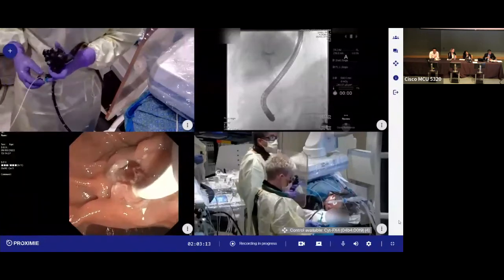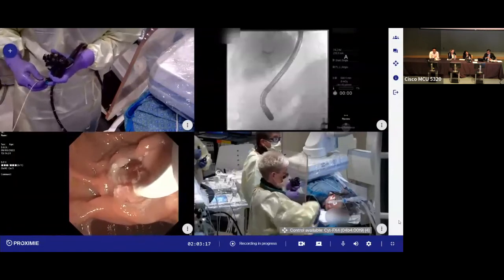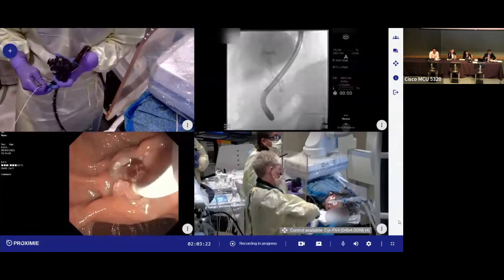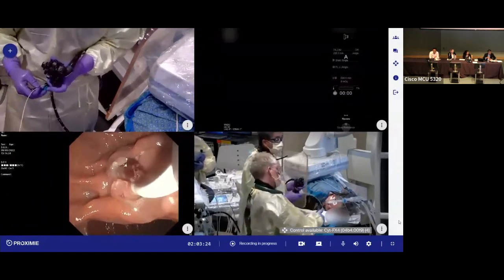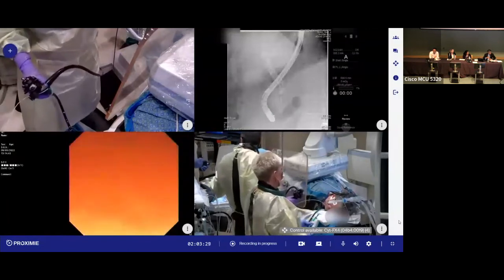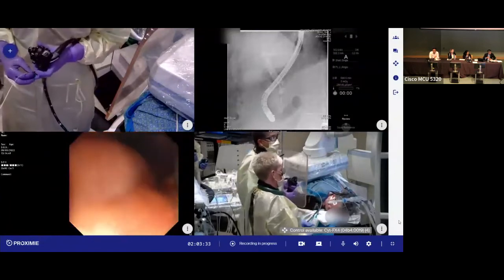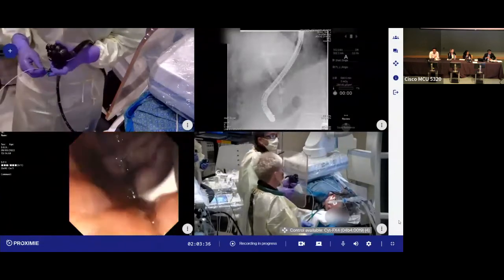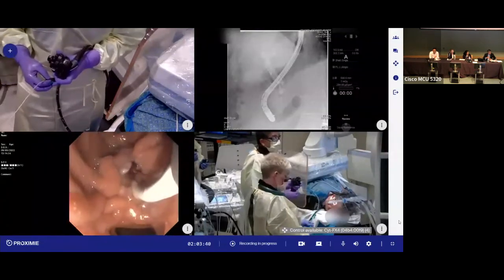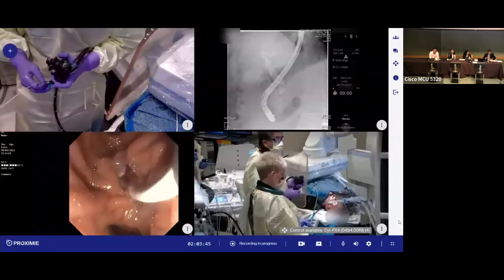And so the 9 millimeter balloon is up now, and I'm going to inject some contrast here. The reason I'm going to do just a touch of contrast is to size up the stone. There we go. Get a nice picture. Stop there. I'm going to send that over to reference, because what I want to avoid is impaction of the stones distally, balloon down. And so you're going to try to split the stone. And as we split the stones, balloon down, that is.